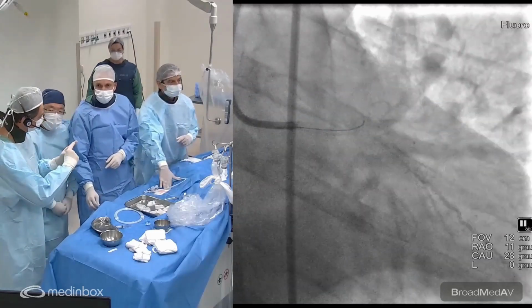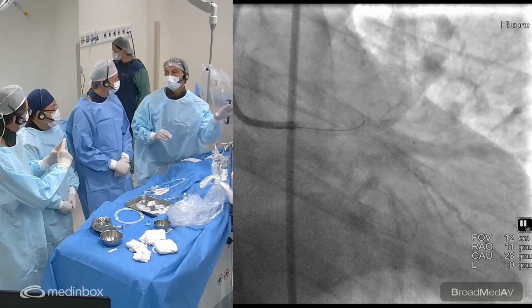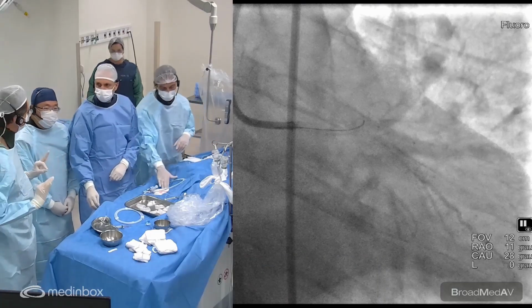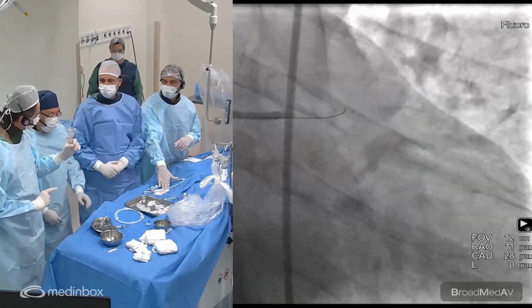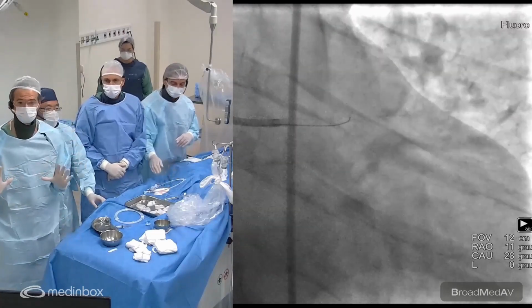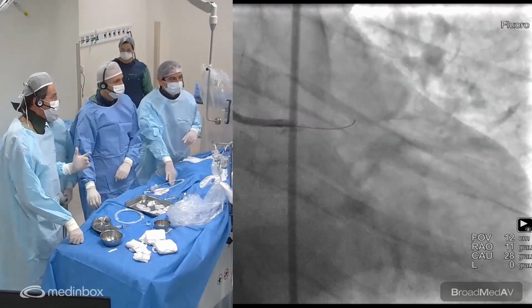Okay, and what's the extension of the bend you do? 1, 2 millimeters, 3 millimeters? In case of total occlusion, a minimal one. Minimal. 1 millimeter. So that's a first lesson: a 45 degrees curve and a very short tip. Short tip. Yes. Very short tip. It's important to know that. So what did you do in the caudal view to get across?